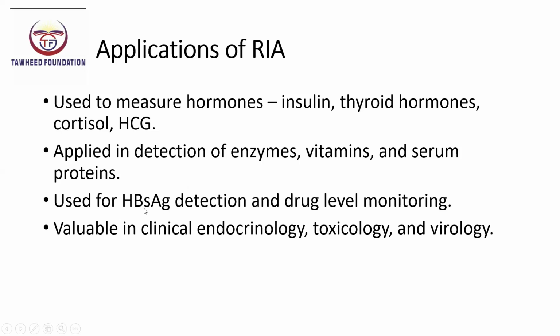Its precision and sensitivity make RIA indispensable in disciplines such as clinical endocrinology, toxicology, and virology, where accurate quantification of biomolecules at very low concentration is required.